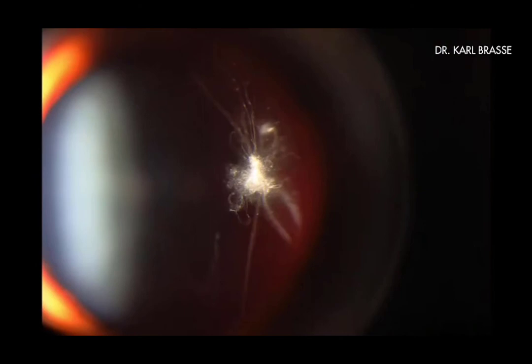If you consider to offer vitreolysis treatments in your practice, you should know that this is not a quick and easy procedure to perform. Furthermore, you can easily traumatize the sensible ocular tissues. My speaking time in the course is restricted and I have to come to an end of Group 3 floaters. But please allow me one more spectacular case. This floater is almost a piece of art. It is not a joke, but its owner was a vitreous surgeon worried to have a vitrectomy done.